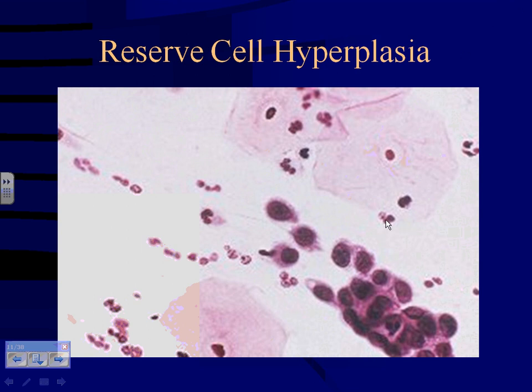They are larger than the neutrophils, which average 35 square microns, remember, your size references. So they're actually closer to endocervical cell size nuclei, but with very scanty cytoplasm. We mentioned in the slide earlier that they're cyanophilic.